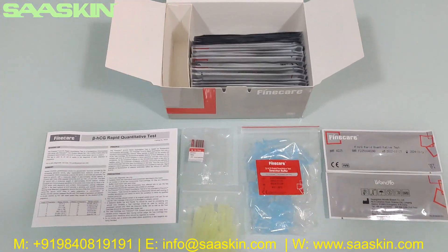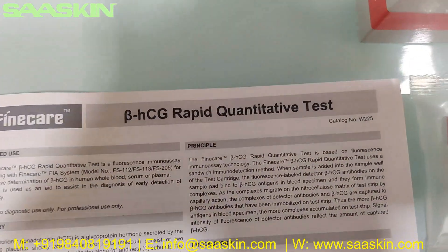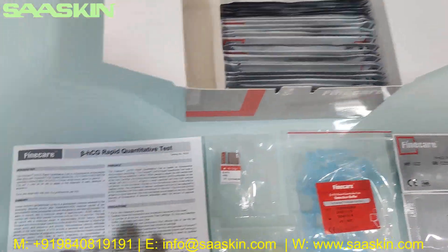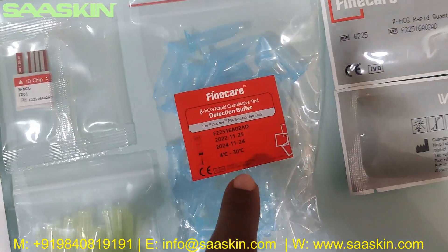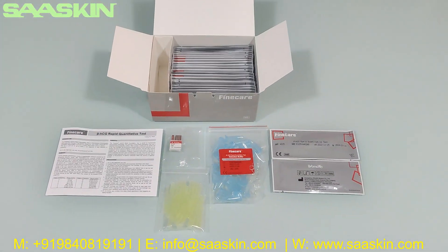This is how the total box looks like. To quickly summarize, today we are seeing the unboxing of Beta HCG Rapid Quantitative Test from Finecare. In each 25 test kit box, you get one leaflet of the instruction for use, one ID chip, 25 pipette tips, 25 detection buffers, and 25 test cartridges. This is how the total kit looks like. Thank you.